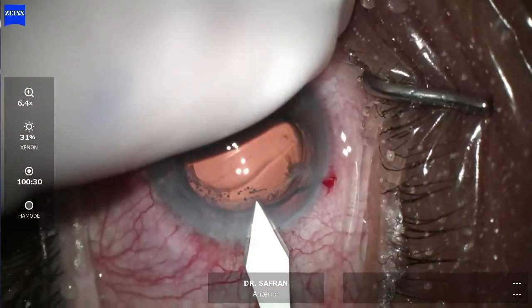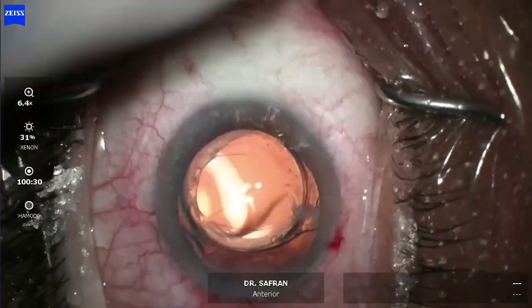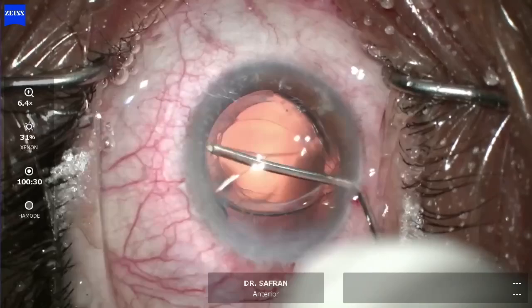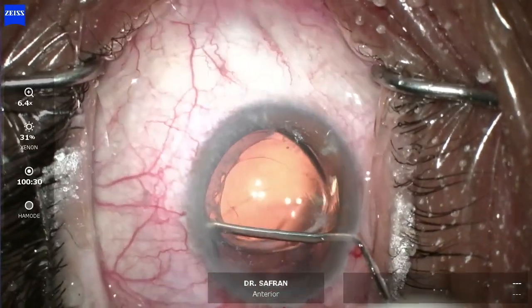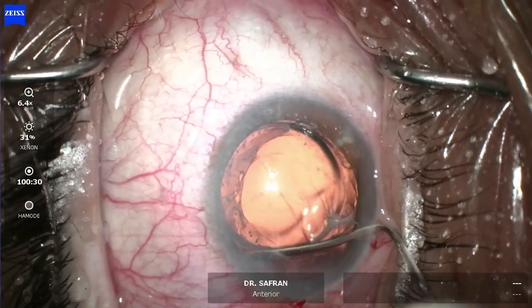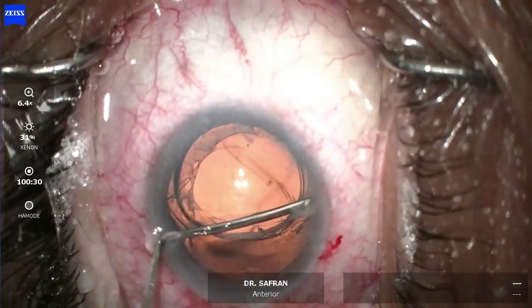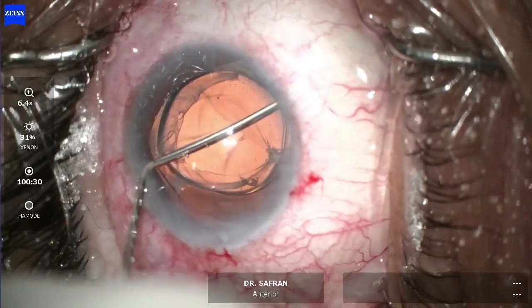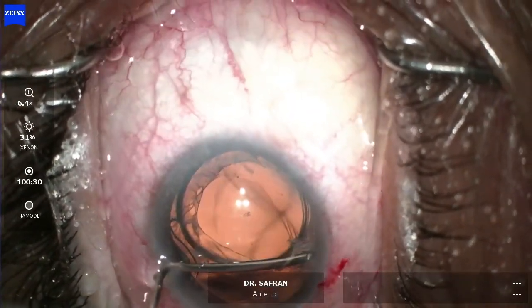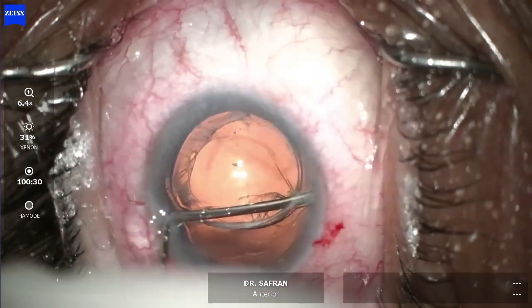We're going to take this patient to the OR. The lens is a little bit dislocated within the capsular bag. We're going to try to reopen the capsular bag using dispersive viscoelastic on a laser cannula, but this bag is pretty well fibrosed — something that tends to occur more with hydrophilic acrylics, especially after femtosecond laser cataract surgery.